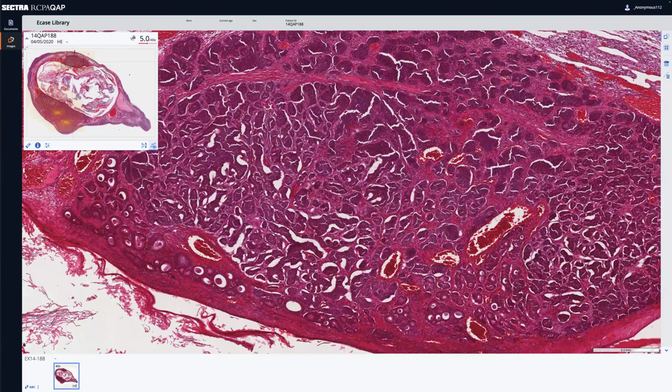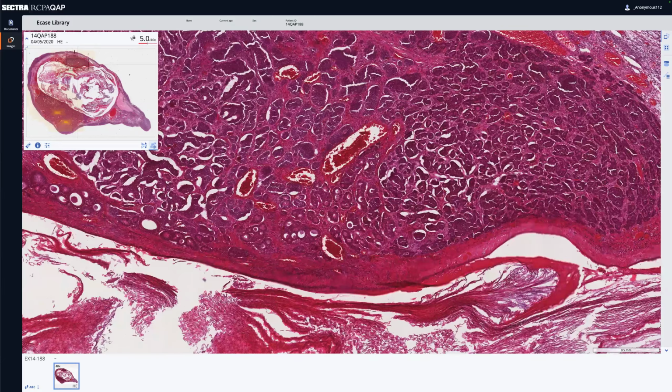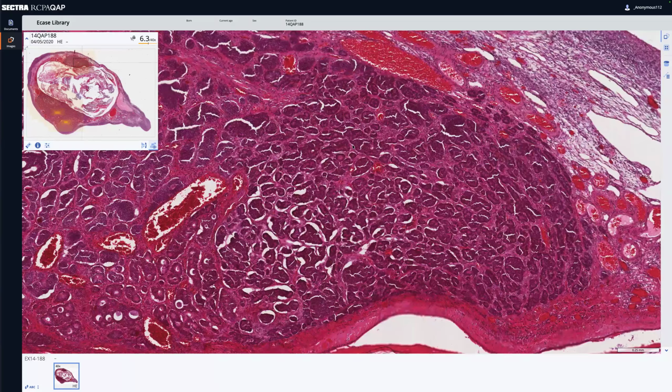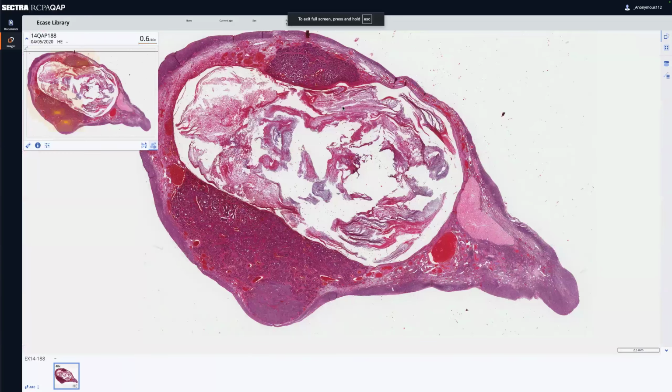Well, A, because I first forgot. But secondly, did you know that these never ever metastasize? These are entirely confined to the ovary. And if you see carcinoid and it's not associated with squamous epithelium, then the thing to do is think, could it be a metastasis from the GI tract? Because we know how much they love to go to the ovary.